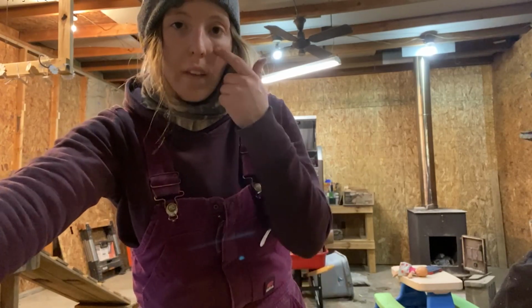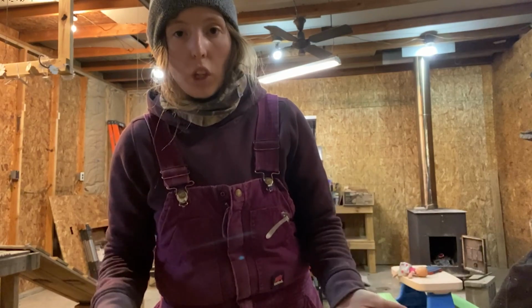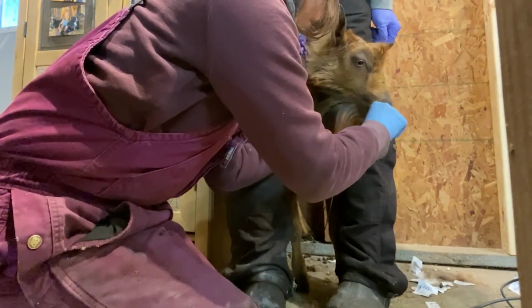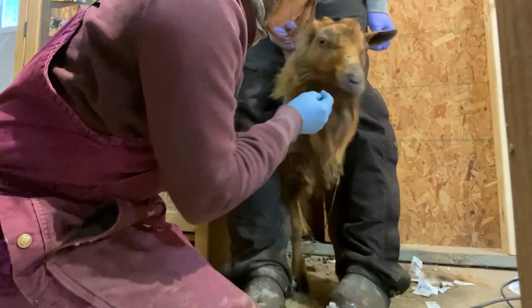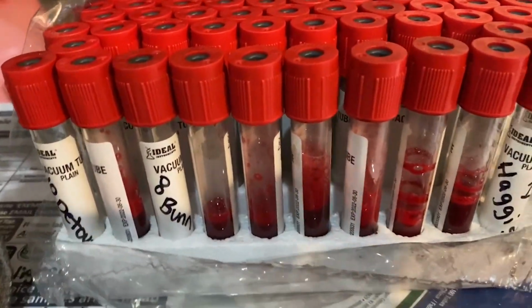Goats are really strong, and they certainly don't want you jabbing them in the jugular, which is unfortunately where you have to draw blood on a goat. Again, we want to make this as pain-free, fast, and easy for both us and the animal.